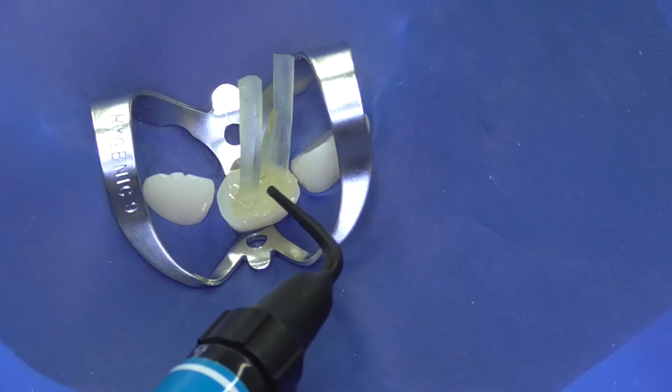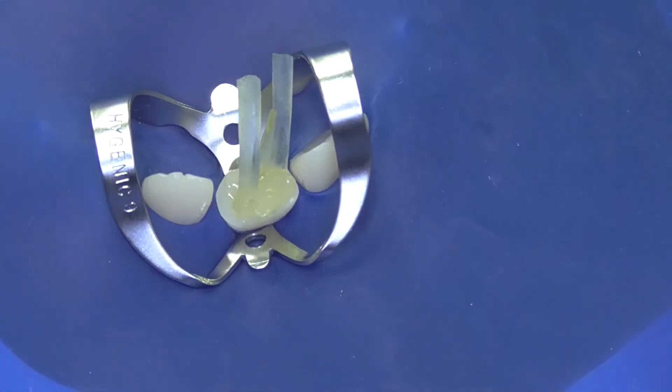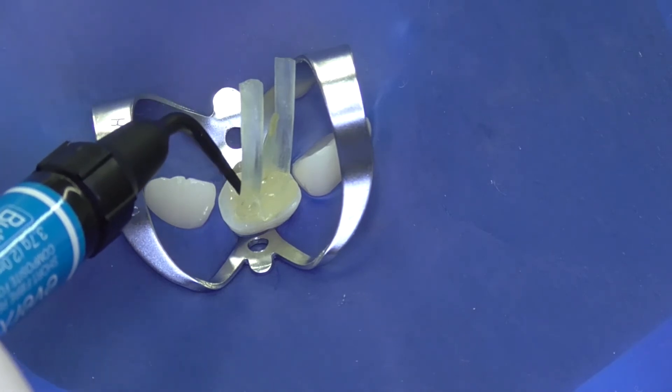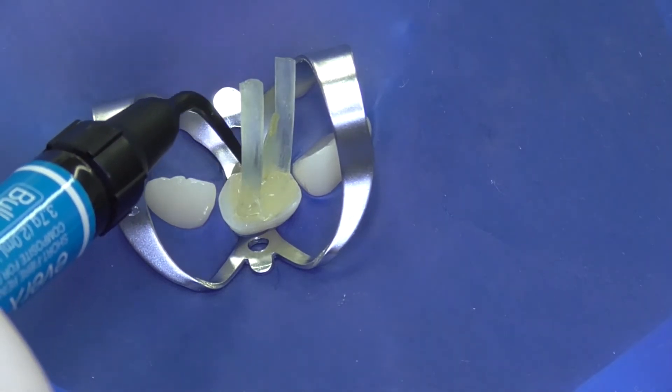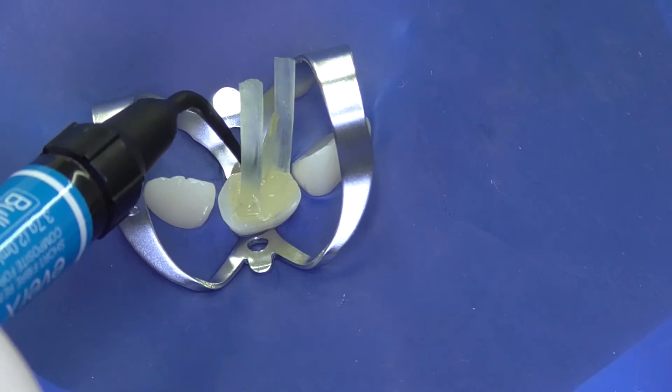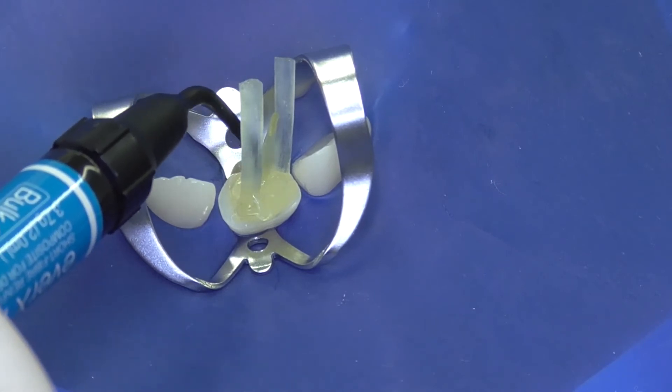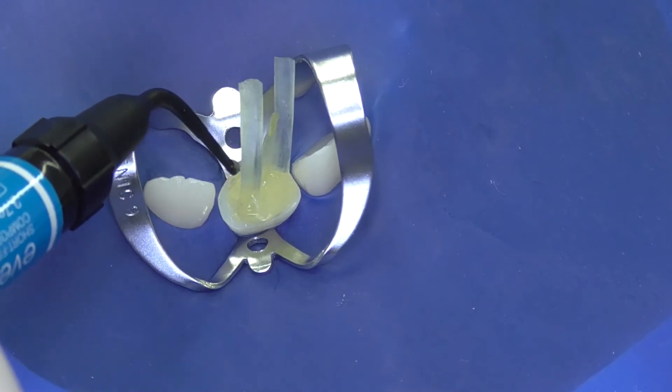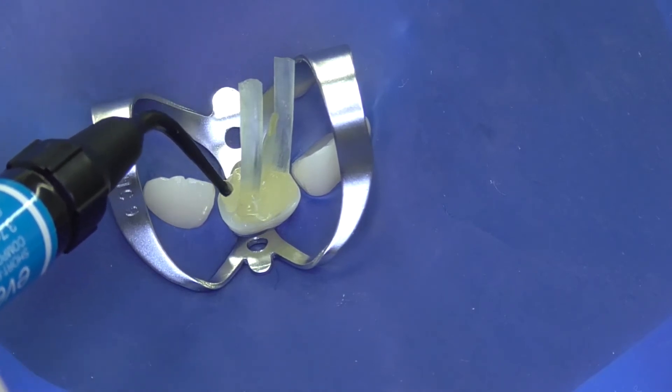Gradually, we are filling all the gaps between the fiber post and building the core on top of the Gradia composite, which was the luting material. Due to the oxygen inhibition layer on the Gradia surface, adhesion of this fiber reinforced composite core buildup material will be optimal.